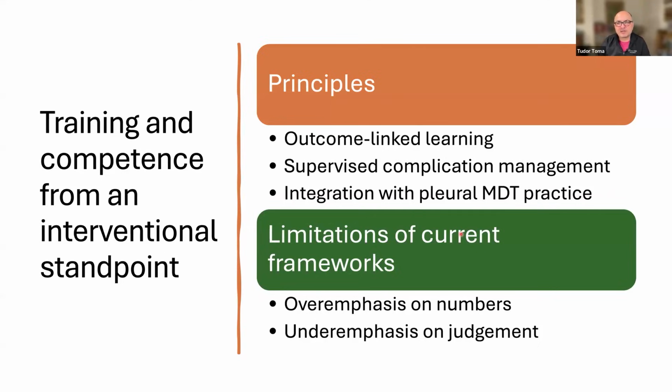The element of outcome-linked learning, mastery type of training, rather than just adding some numbers to procedures, and also the element of eye-hand coordination, which is essential for interventional bronchoscopy, is also essential for thoracic ultrasound.